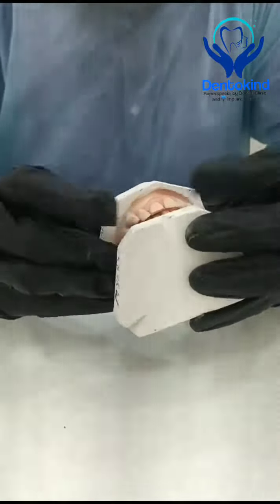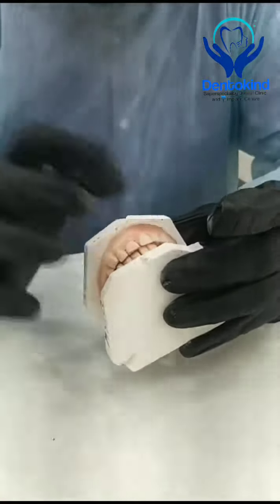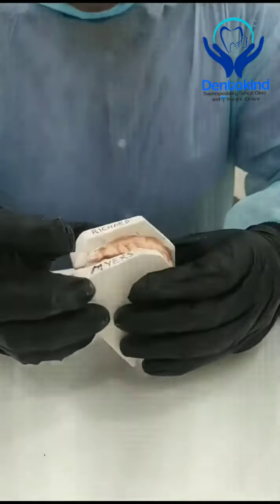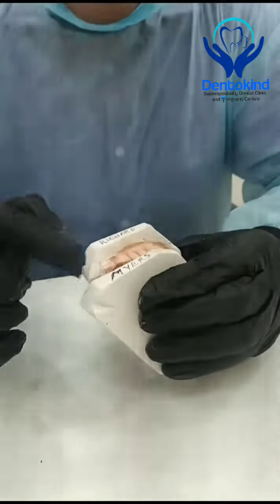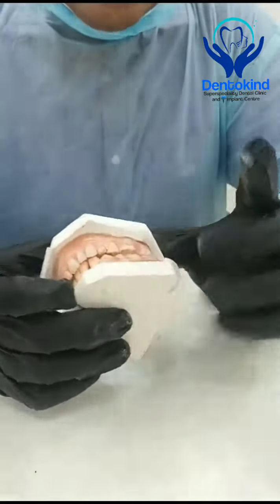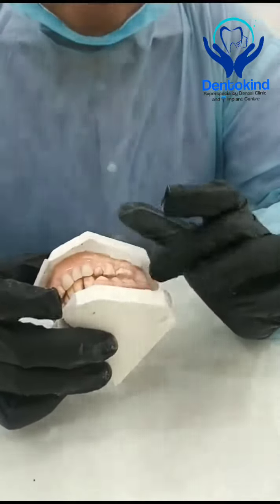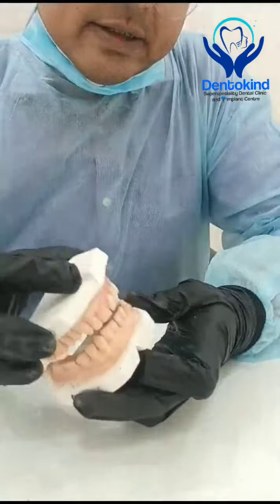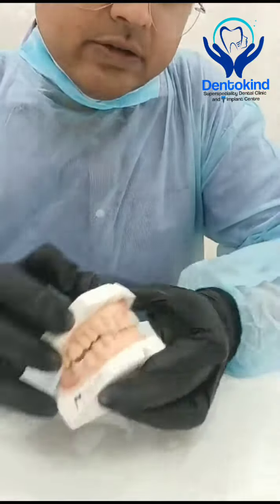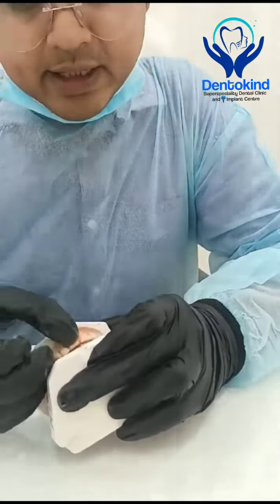For aesthetic purposes, since they were missing anterior teeth, there won't be any gap or space in the anterior region and they will have a pretty smile. They can also chew bilaterally — on the right side with the molar and on the left side with these molars — so they can chew food bilaterally and have a good smile.